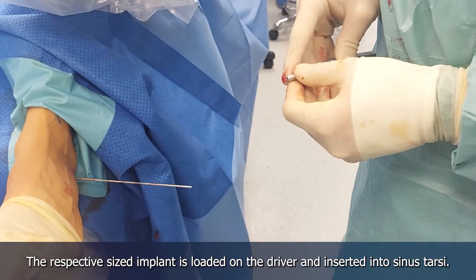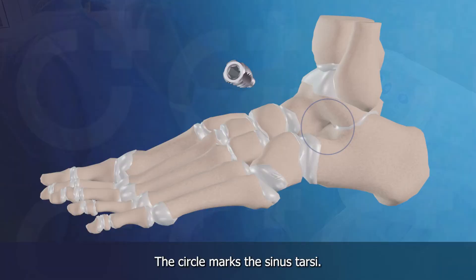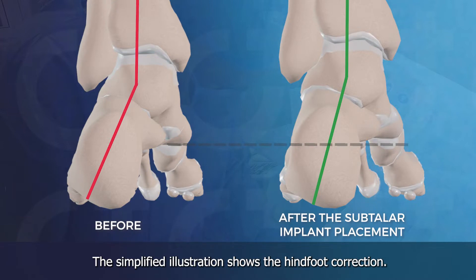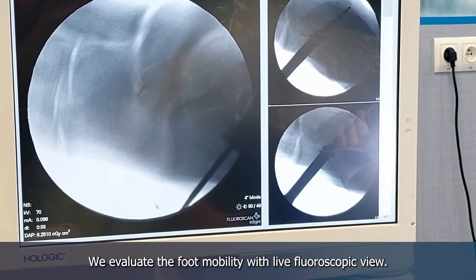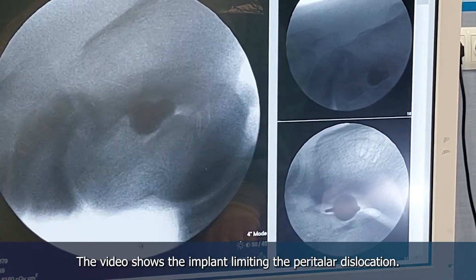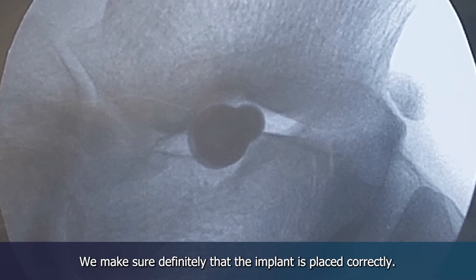The respective size implant is loaded on the driver and inserted into the sinus tarsi. The circle marks the sinus tarsi. The simplified illustration shows the hindfoot correction. We evaluate the foot mobility with the live fluoroscopic view. The video shows the comparison of foot mobility without and with the implant, demonstrating how the implant limits peritalar dislocation. We make sure definitively that the implant is placed correctly.